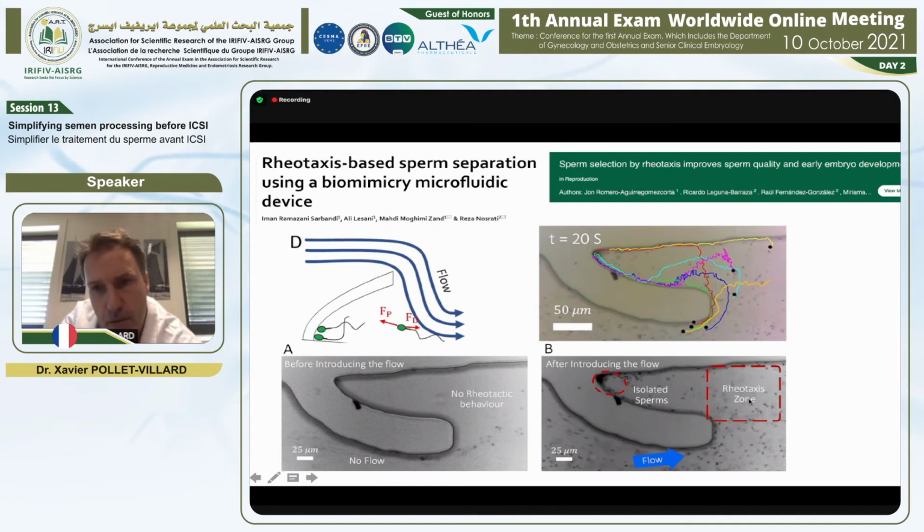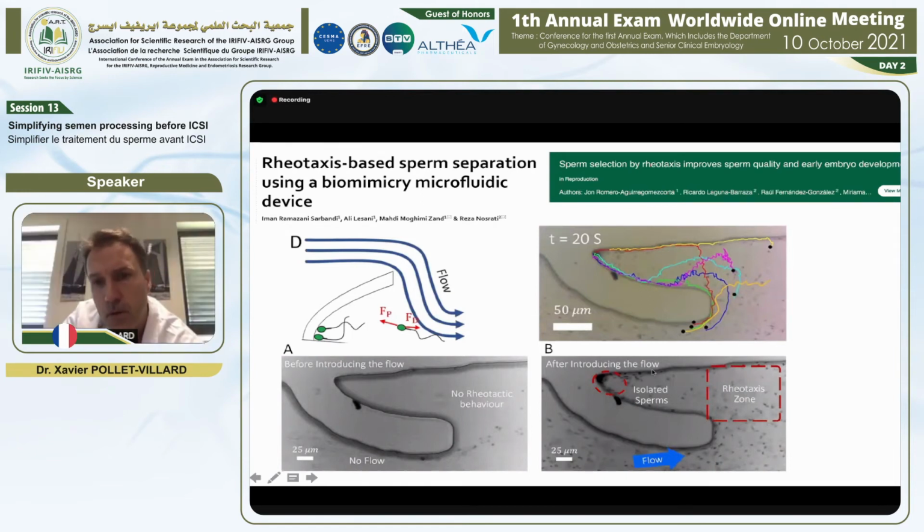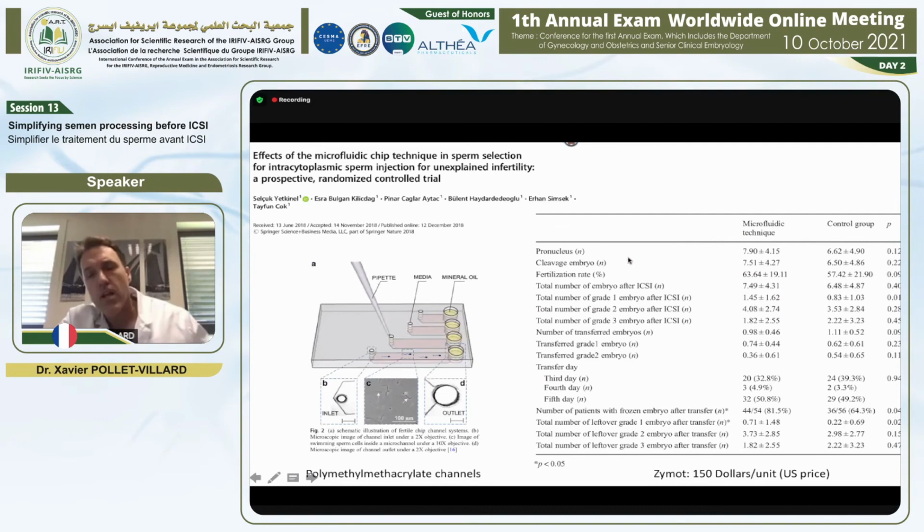If you add the flow, there will be a selection zone, which we call the rheotaxis zone here, where the spermatozoa will orient against the flow, and the most motile ones will be able to concentrate in the cavities. And you can see here the tracks of the motile spermatozoa going against the flow and then pushing into the cavity. So rheotaxis is implicated in really a lot of sperm selection techniques that use flow or that use the motility of spermatozoa as a prime selection method.